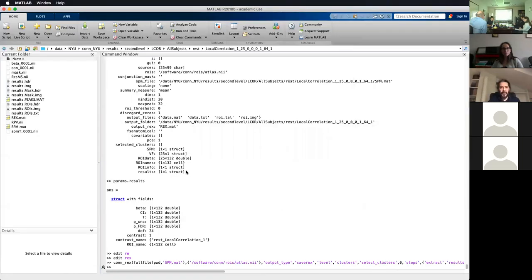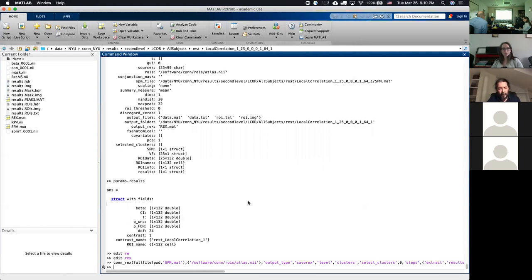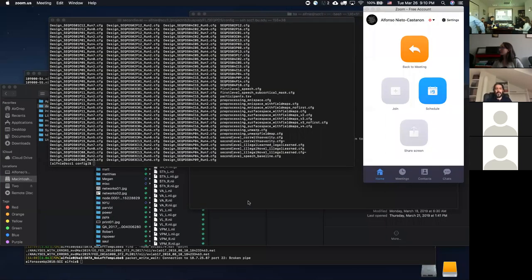Yes, there is, let me remember how it was called. There is either an SPM command for doing that or a conn command. I don't recall. I'll look it up.